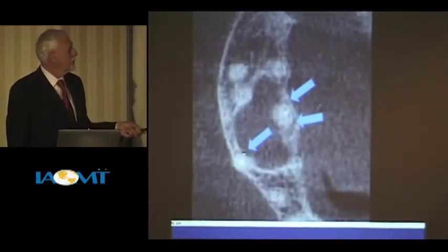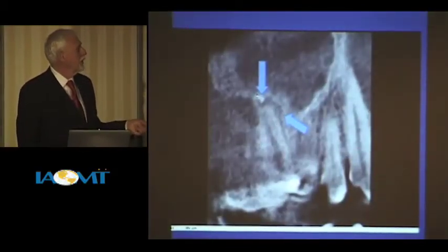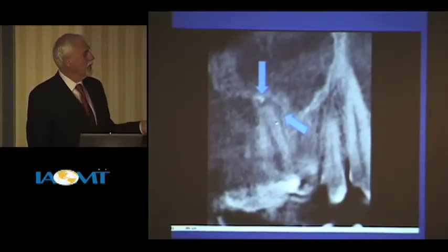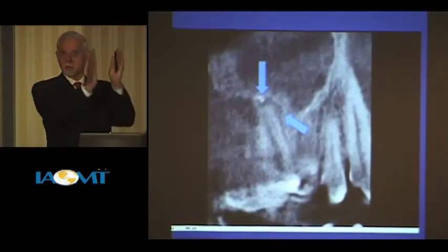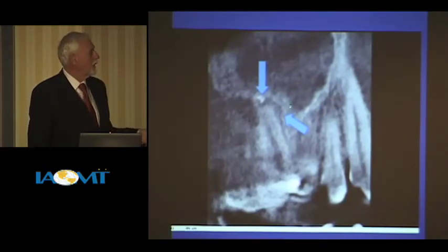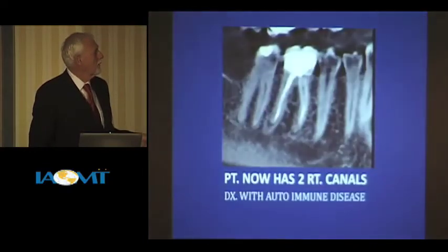Okay, look at the lesion here, and look at the lesions here, and look at the lesion here. Again, you can see a little bit of root canal sealer out here. And again, you can see how we don't have the full side view of the tooth. That's because I'm moving in and out, because I want to know if the bone and the tooth fit together like this. If they don't, then there's an issue. There's a problem there. Look at the little radiolucency to the side of this.